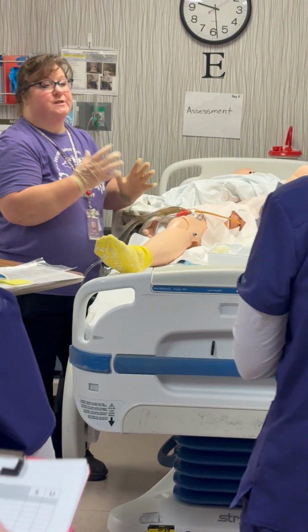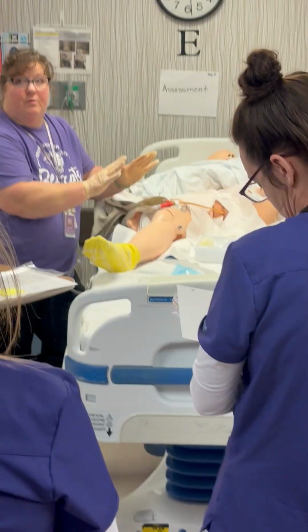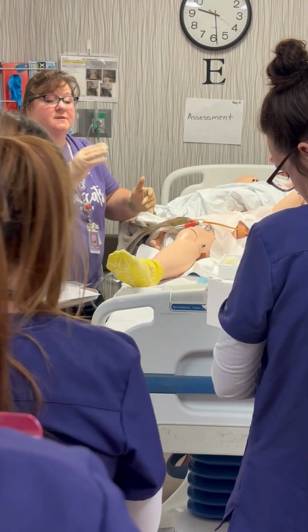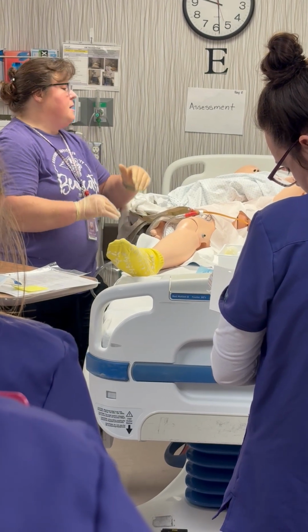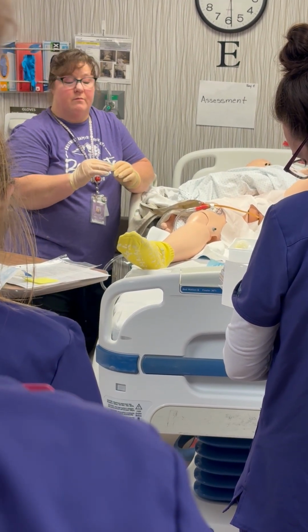And then you're going to take your gloves off. You're gonna verbally tell me this, because you're gonna take this out. You don't wanna take it out yet, okay? And then you're gonna say, I'm gonna take my gloves off, wash my hands, then I'm gonna go document what I'm gonna document, okay? Make sure the bed is lowered, make sure the patient has their call light, all of those things, okay?